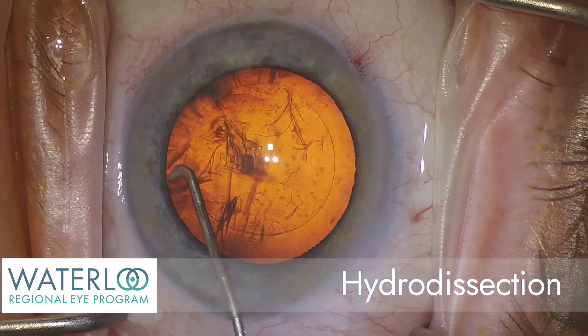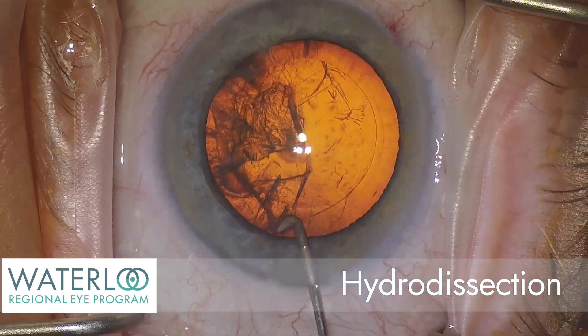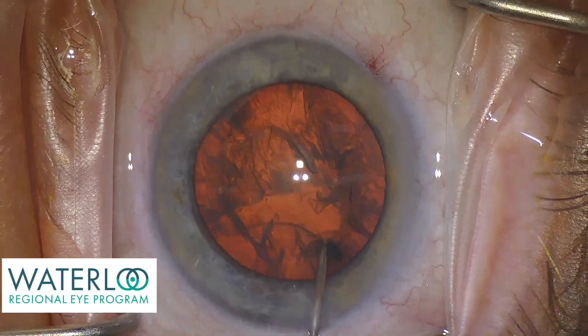In hydrodissection, fluid is gently irrigated between the capsule and the cataract, separating them and allowing the cataract to rotate so that it can be broken up into fragments.